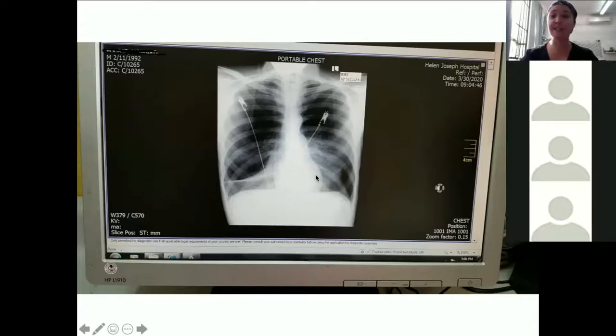Cardiothoracic ratio looks great. Diaphragms look great. You can see those nice and clearly. And only about half of you were really excited to put in a chest drain. I can't wait to put in a chest drain on this patient. This is going to be a lovely patient to put in a chest drain on the right-hand side.